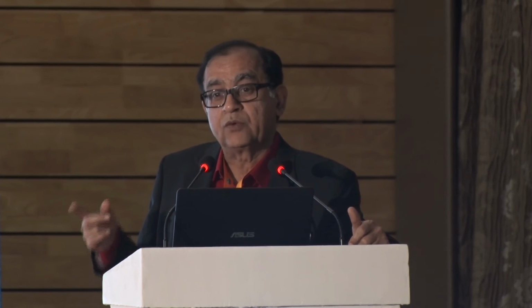And this is it. And these are so toxic. Immediately after surgery, the patient had very good vision, but the story never ended actually. I'm not going further. The next time, the patient had so much fibrosis that in spite of immediate vitrectomy, we had to do a second retinal surgery. And then again, the third time he had a detachment, so we had to do retinal surgery thrice for this patient.